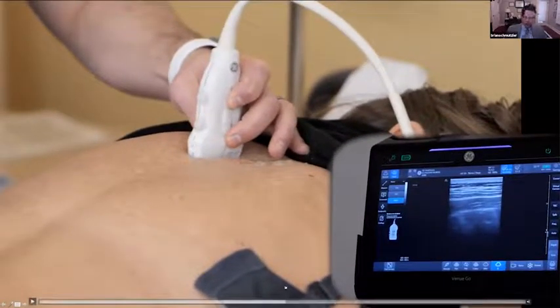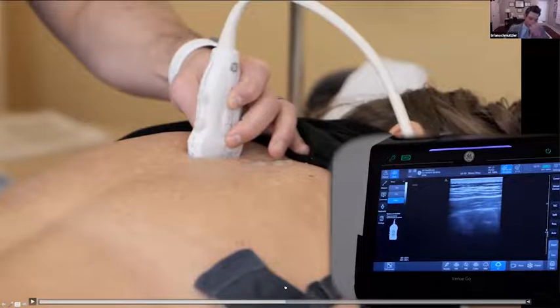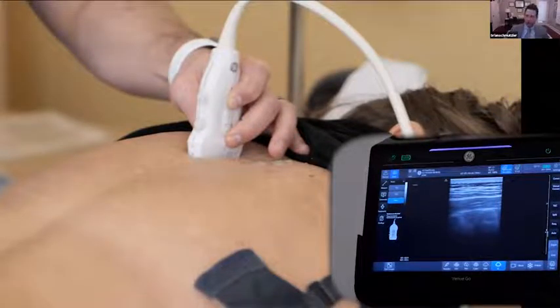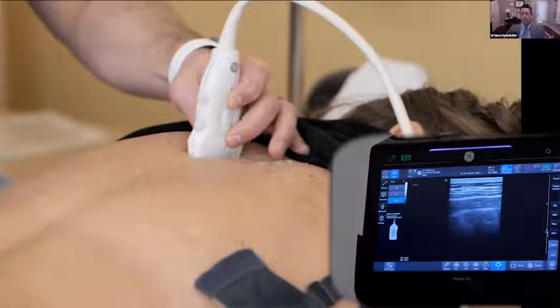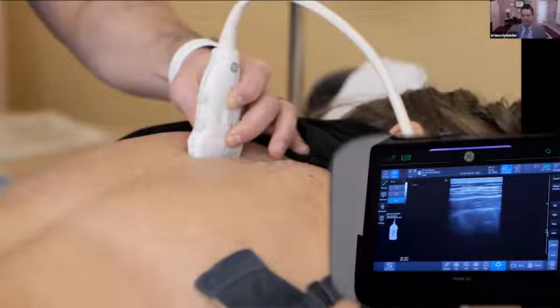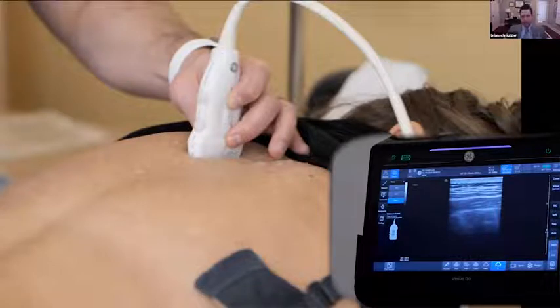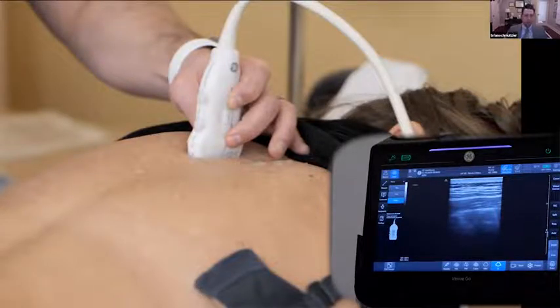So that gives you a sense of what we do for our scanning. I'll spend a significant amount of time scanning until I see exactly what I want. Especially when I first started doing these, I'd spend a good 10 minutes scanning just to make sure I knew exactly where I wanted to be.